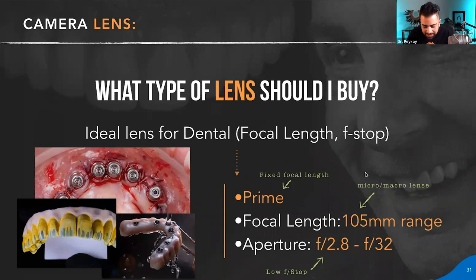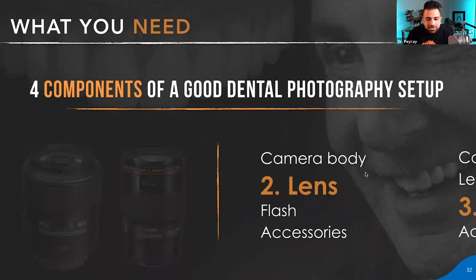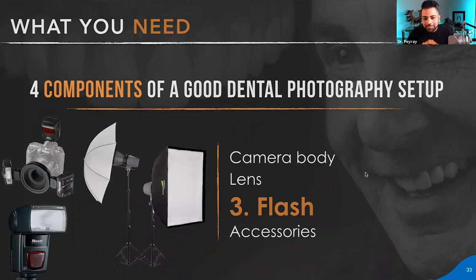I'll talk about the aperture in a second, but this slide gives you the three criteria that I would say are important if you're looking for a lens. Now, once you've covered the lens, the flash is very important too, because it's all about the lights.